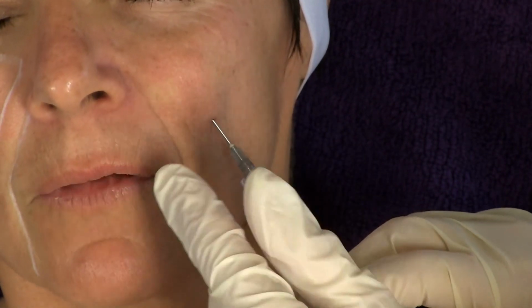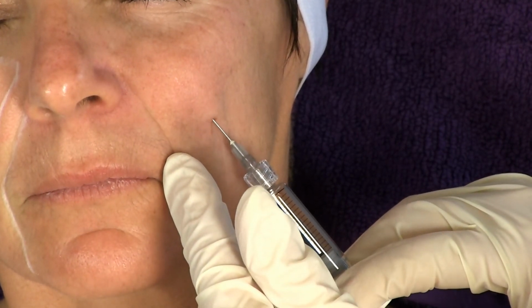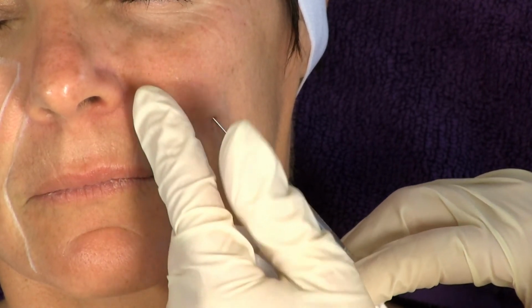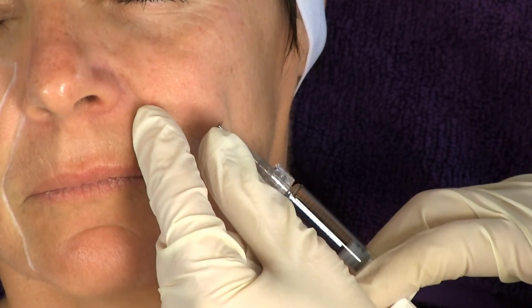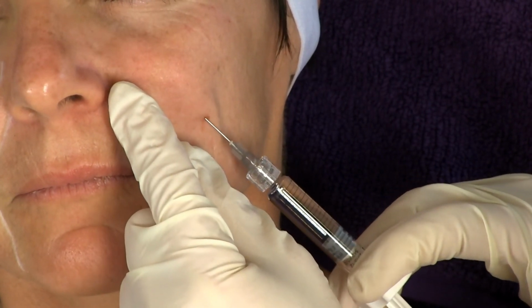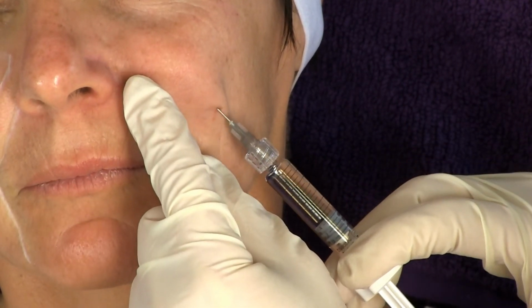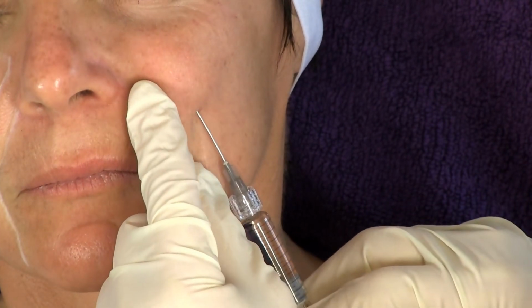Inject multiple strands of filler using the fanning technique in a retrograde manner. Maintain depth to inject at the supraperiosteal level. Gently shape and mold the material to the desired cosmetic effect.